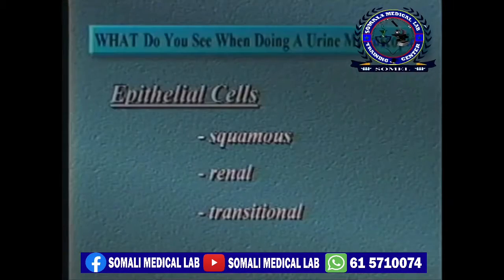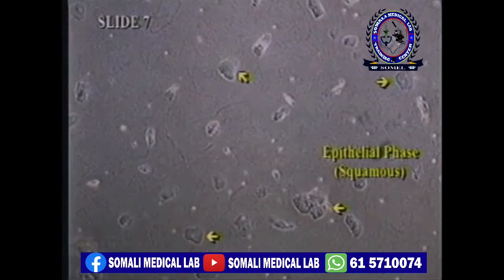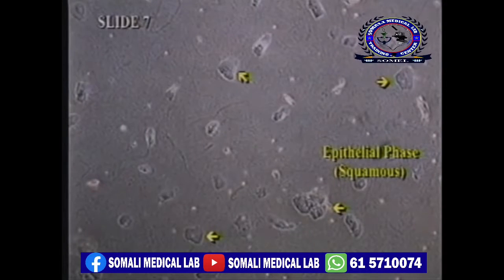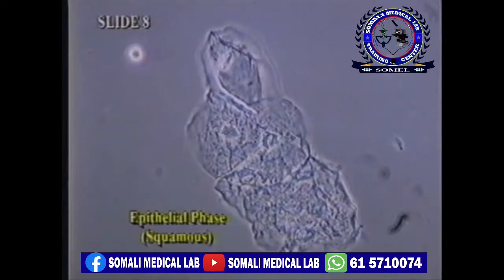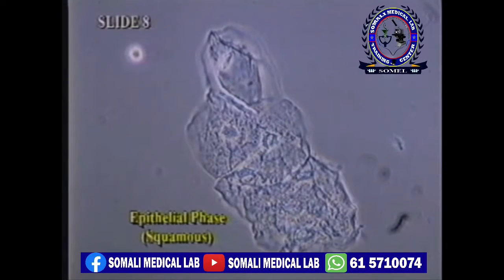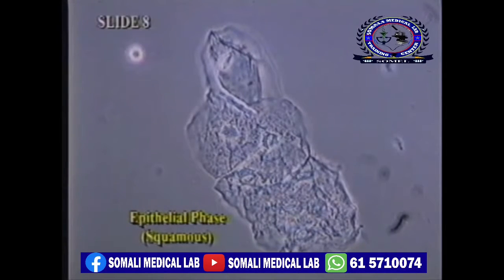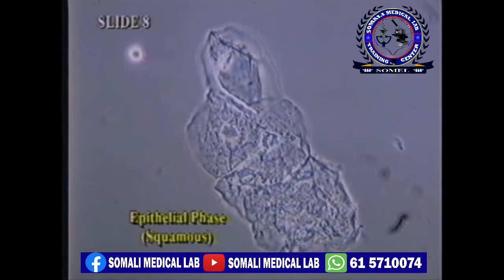Let's look at some epithelial cells. There are 3 types that need to be recognized and reported: squamous, renal, and transitional. The first are squamous epithelial cells that you see in this slide. This is a low power view under phase. This is a higher power view of squamous epithelial cells. They are large, irregularly shaped cells with a small nucleus. It is not a significant finding to see these cells in sheets or clusters.